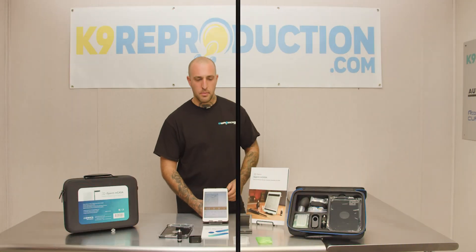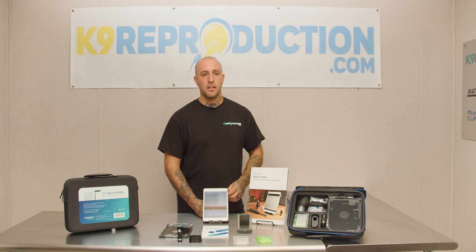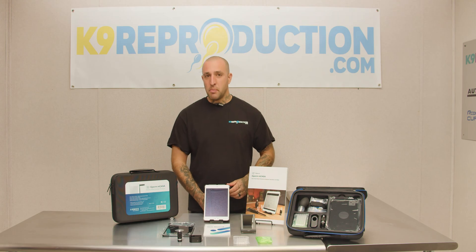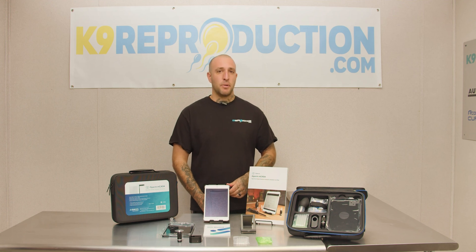When it comes to semen analyzations, there's really nothing better on the market for fast, accurate and reliable results. Aidmics is really setting the standard for compact, easy to use and cost efficient. To learn more about the iSperm system, visit us at k9reproduction.com.